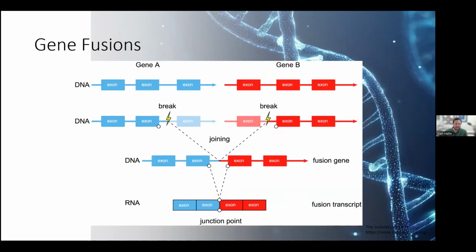Next, we have gene fusions, where we have parts of one gene connect to parts of a different gene, which impacts function when we report it and when we're looking for it. And this impact on function is what is contributing to the disease state. It could be done by DNA or RNA sequencing, with most labs using RNA sequencing to cut out the variable and long intronic component, so that we're just looking at exons, which will be easier for us to detect. And also incorporating expression, which is the amount of RNA being made. That tends to contribute to the oncogenicity of the fusions.